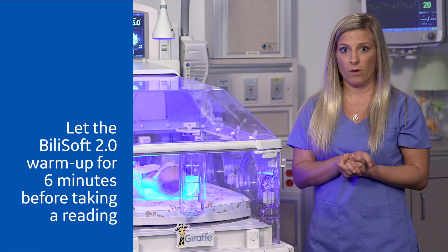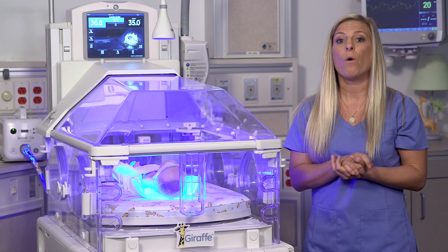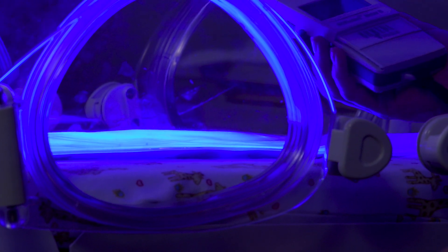While you are waiting six minutes for it to warm up, place the fiber optic light pad on a flat surface. Do not place the fiber optic light pad inside of a BillySoft pad cover or BillySoft Nest at this time. Use a calibrated Billy meter that is approved for the BillySoft 2.0.